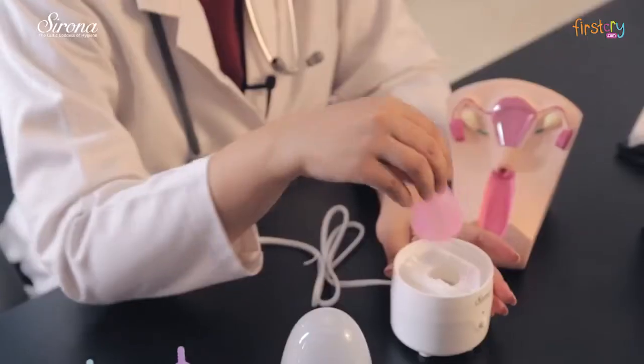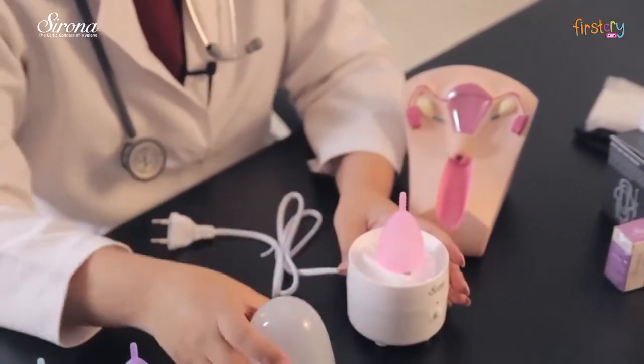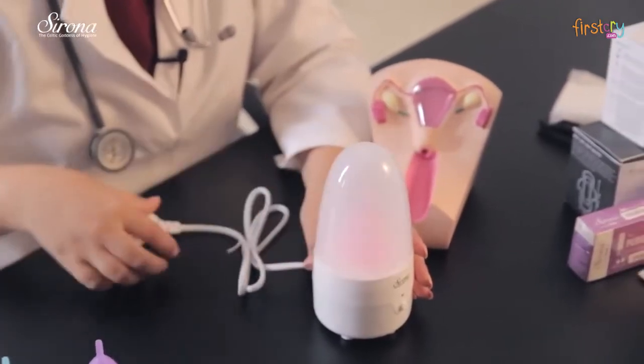Put the menstrual cup upside down, cover it, plug it into the power source and simply put it on. This switch will auto switch off after 2 minutes. You can keep it for 3-4 minutes.